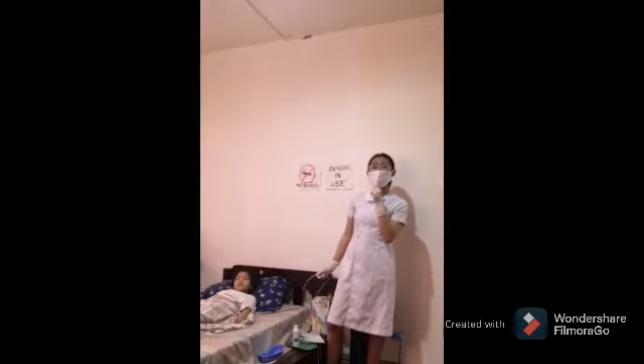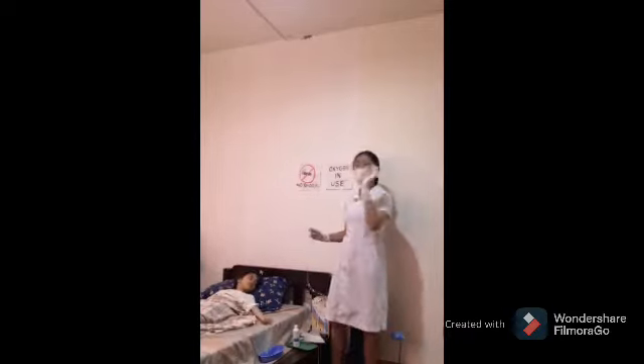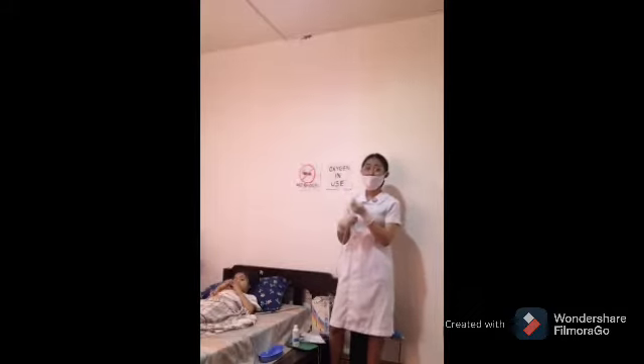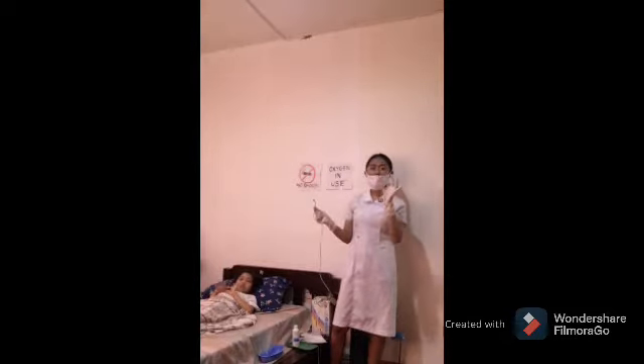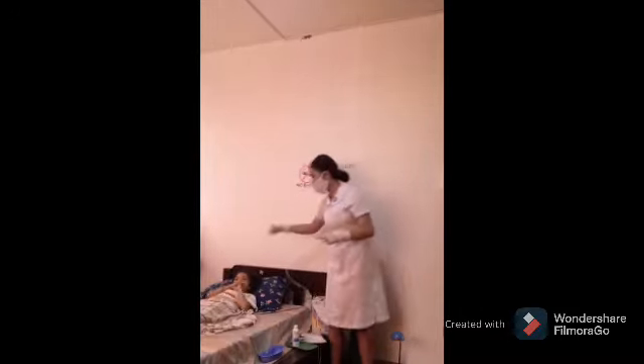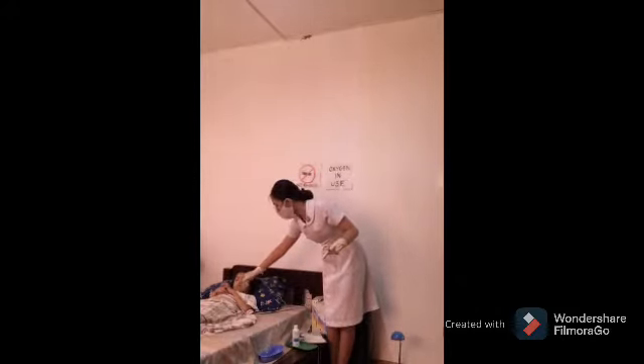We will remove the oxygen delivery device if appropriate. Do not apply suction as the catheter is being inserted — release your finger from the Y-port. Hold the catheter between the thumb and fingers, then apply suction by occluding the Y-port with the thumb of your non-dominant hand. Gently rotate the catheter as it is being withdrawn. We use rotational motion so that we can collect all the secretions and to avoid damaging the mucosa of our client.